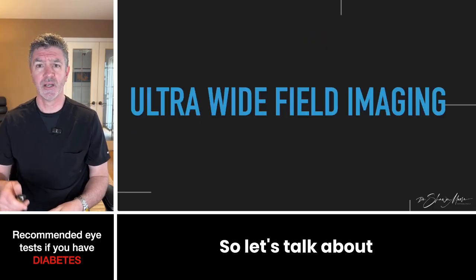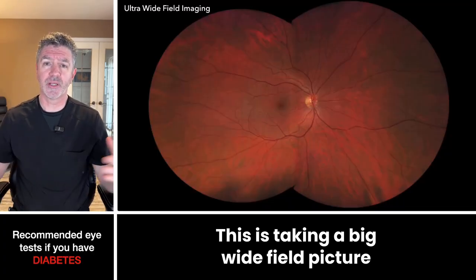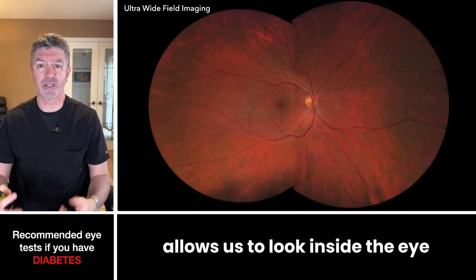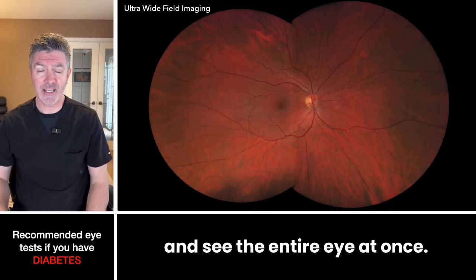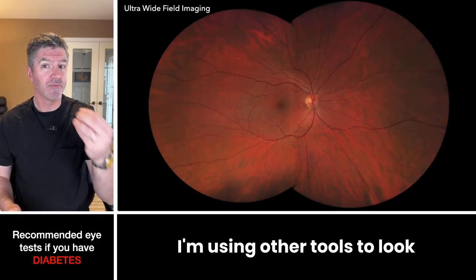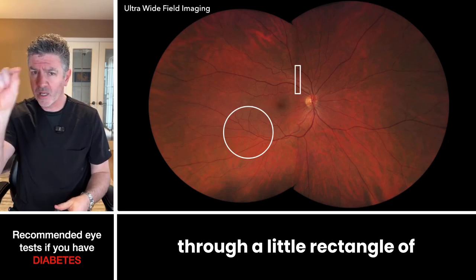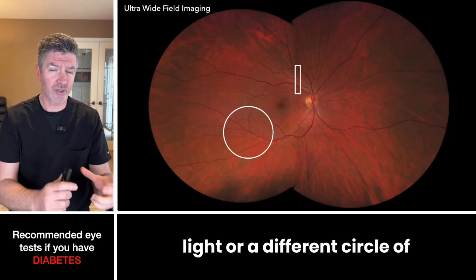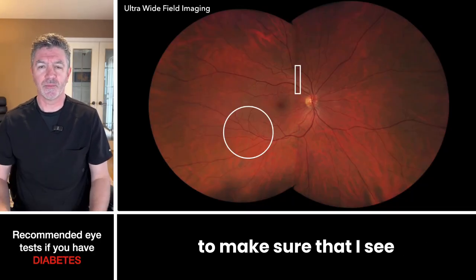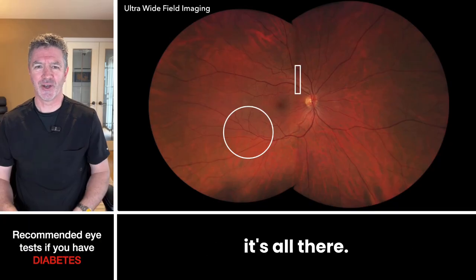So let's talk about ultra-wide field imaging. This is taking a big wide field picture of the back of your eye that looks like this. And that allows us to look inside the eye and see the entire eye at once. It's absolutely amazing because if I'm using other tools to look inside your eye, I'm looking through a little rectangle of light or a different circle of light, depending on what instrument I'm using, and I'm trying to move that around to make sure that I see the entire back of the eye. But when I take the picture, it's all there.